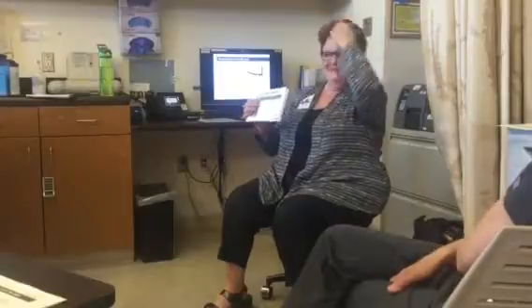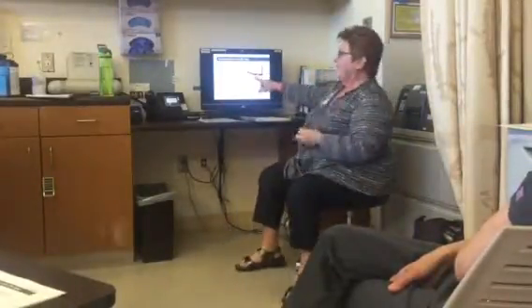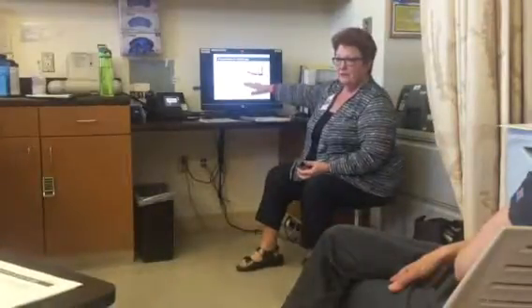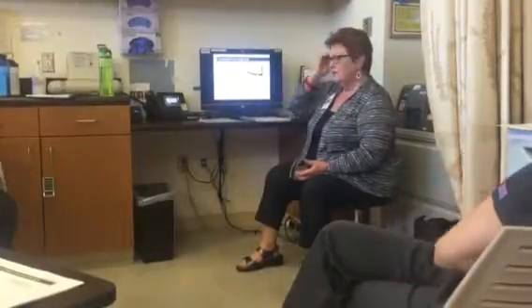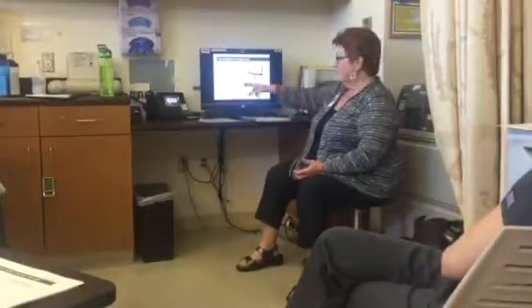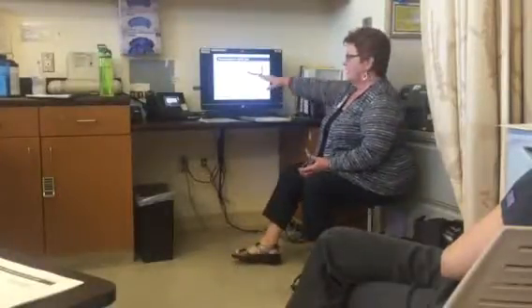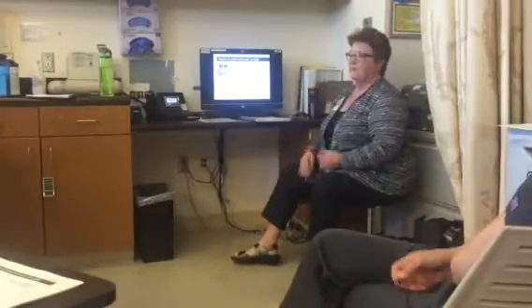I'm on the road. All right, so that's accumulation of a buffy coat. When there are options listed on the troubleshooting, we would really like for you to try the top one first. That's why they're listed in this order, okay? Unless, of course, you're not happy with the color of your collection preference, then you would change that, but always go top to bottom, all right?